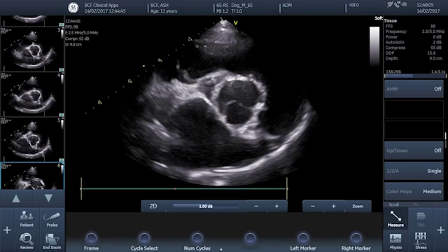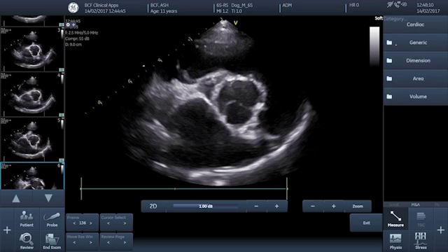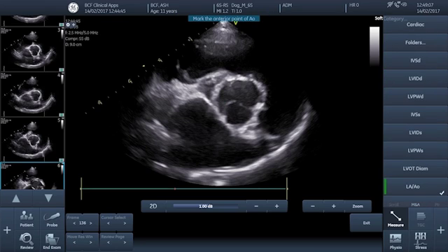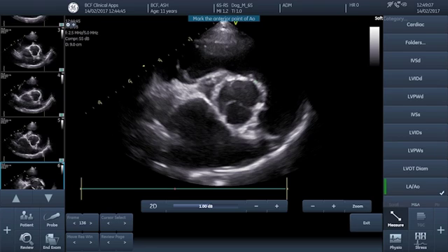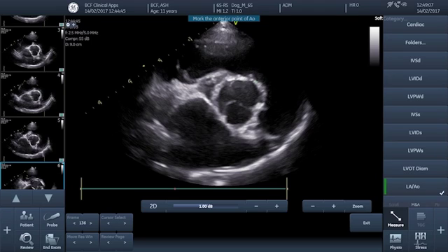Having found the first frame in which the aortic valve leaflets have closed and formed the Mercedes-Benz sign, select LA AO from your measurements menu — exactly how you do that will depend on which machine you use, so consult your colleagues or your ultrasound machine instruction manual if unsure. In most cases the machine will prompt you to measure the aortic root diameter first and subsequently the left atrial diameter. Check which your machine asks for first, because most machines then calculate left atrial diameter divided by aortic diameter for you — if you measure in the wrong order you may end up with the inverse result.